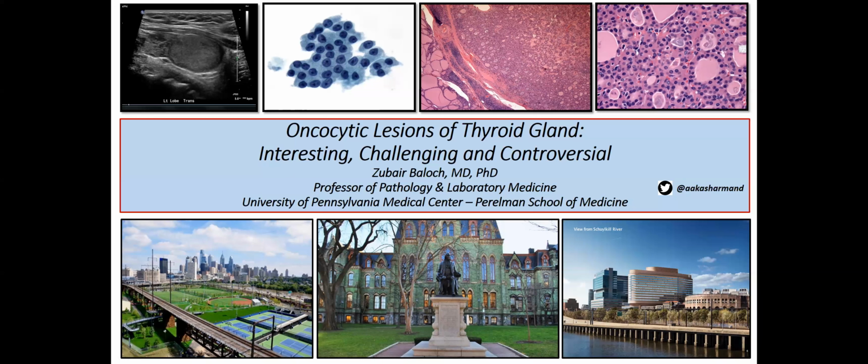Because I think they behave differently. They also have different morphology, and they have a lot of things that they can mimic. And a lot of other lesions have oncocytic cytoplasm. So I think this is kind of an important feature.